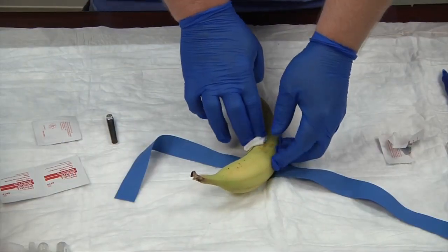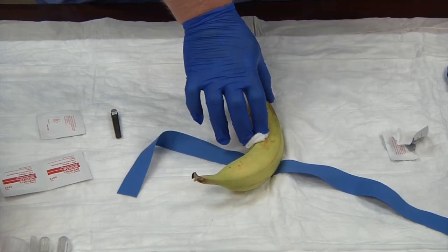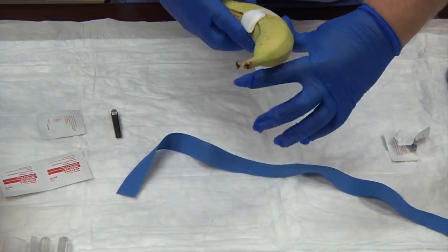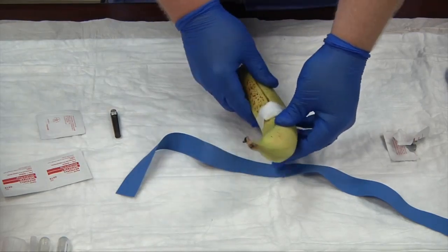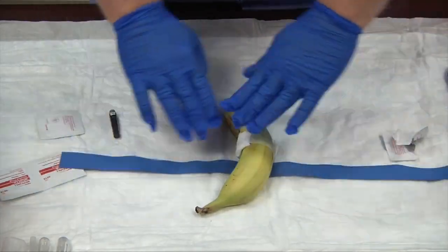I'm holding direct pressure on the site for a few moments. I have my tape already torn and ready to go. We're going to bandage our patient, making sure we have a good tight seal — tight on the bottom and tight on the top. And that's how you can practice doing a phlebotomy blood draw on a banana.